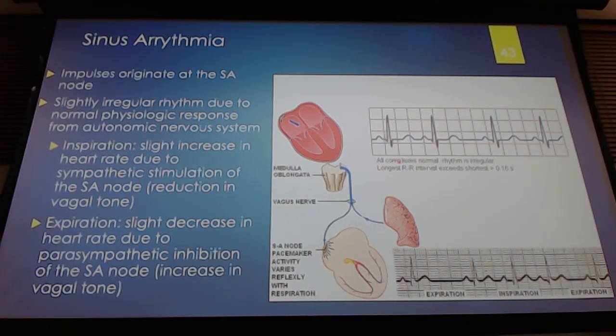Typically at the top of the ECG, it'll say sinus arrhythmia. When you look at the bottom, you're watching the patient breathe, and you'll see when they breathe that it matches up specifically. How many times do we breathe in a minute? 12 or so. Okay, well, in that 10-second strip, how long is that? Maybe a couple of breaths. Maybe you'll see 1 or 2 beats on there that will tell you this is a sinus arrhythmia. Okay. And it's all due to these people, again, you don't see it very often, but it's because the sympathetic and parasympathetic tone is being activated by inspiration and expiration.